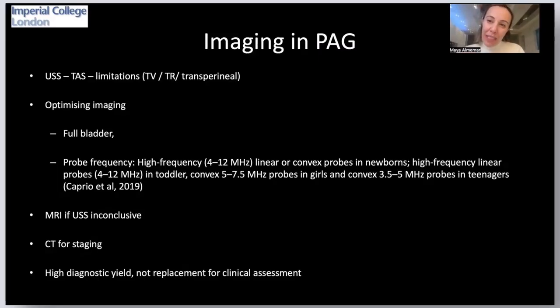In the majority of cases in pediatric and adolescent gynecology, we're probably going to use a transabdominal approach, and this will give us most of the answers that we're looking for. However, we know that particularly for pelvic imaging, and particularly as young women become adolescents, it's most reliable to use transvaginal or transrectal imaging. Of course, you can also apply transperineal imaging. The challenge with transvaginal and transrectal imaging in this cohort of patients is that it's not always acceptable in young people, but also sometimes it's not something that they would want us to do.